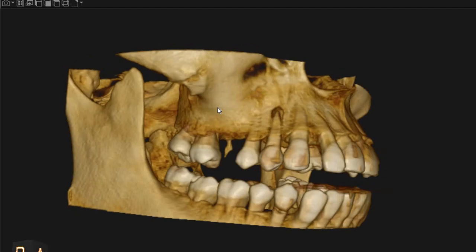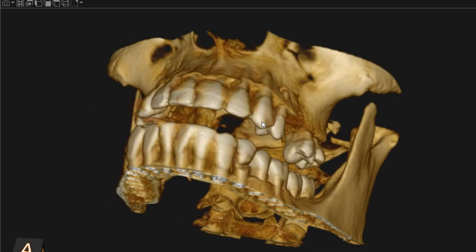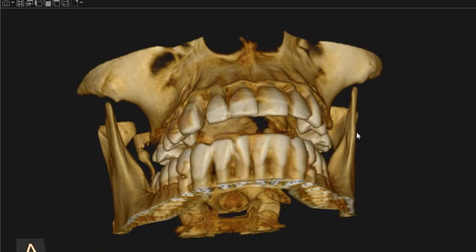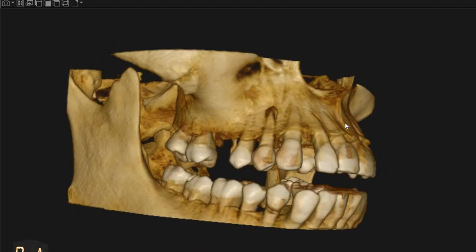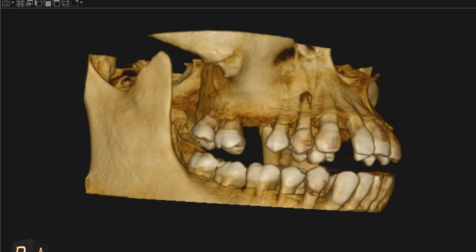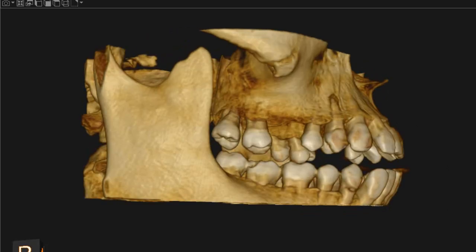Assalamu alaikum, Ultrascan Diagnostics. This is the CBCT of the patient who had requested. The area of interest is the upper right and the upper left quadrant.